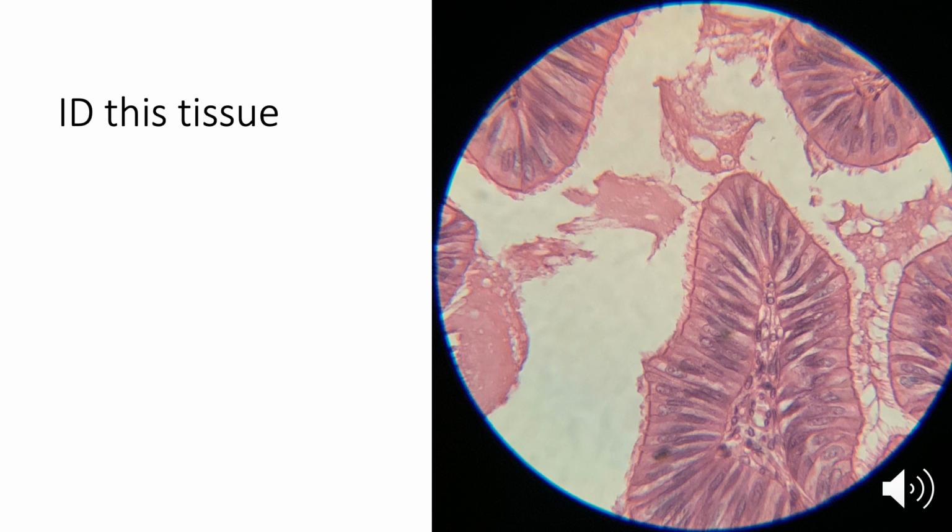Okay, here's our next tissue type. This tissue does have an apical surface, so I'm looking here at these cells, and they come up next to an empty white space, so here's my apical surface. Here's my basement membrane down here, and if I look at that cell, it's very elongated and columnar in shape.